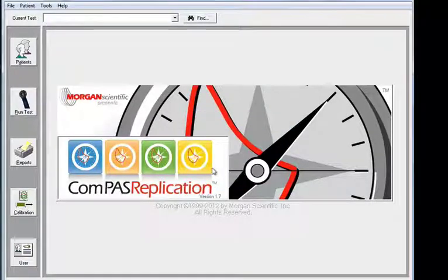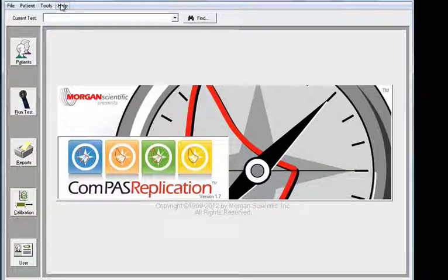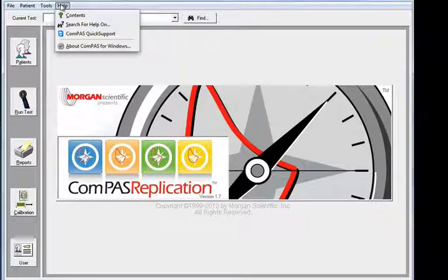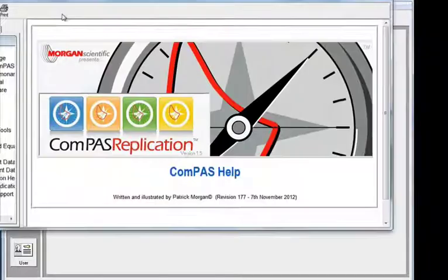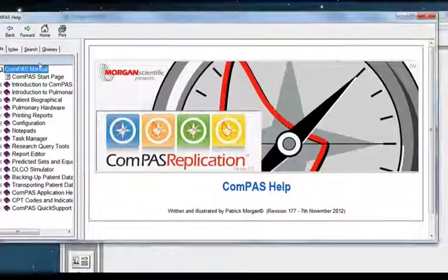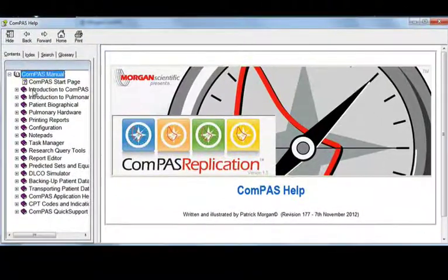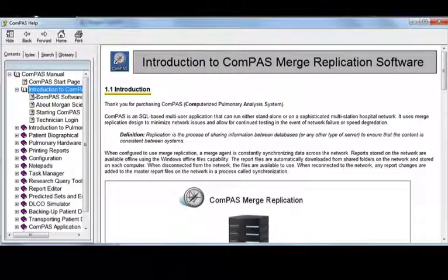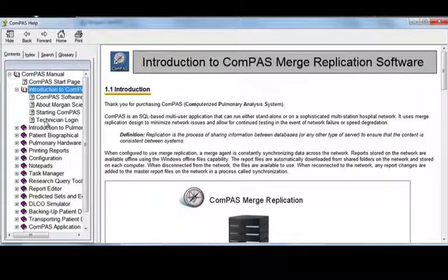Now, every version of Compass comes with a fully integrated help file. Simply mouse up to Help, click on Contents, and from there you can navigate using the left-hand menu system.